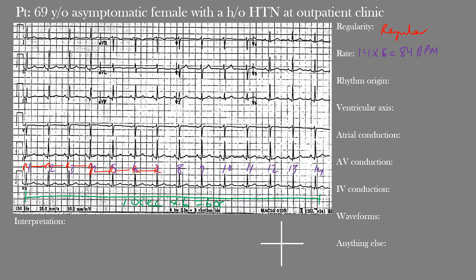Because we're dealing with a regular rhythm, we can also use the 300-divided-by-big-boxes method. Find an R wave that falls on a thick line, then count the number of thick lines until the next R wave — in this case, about four. 300 divided by 4 equals 75 beats per minute. Most EKGs will display the rate automatically, but always verify it yourself. The actual rate in this case was 83 beats per minute, quite close to our estimates.